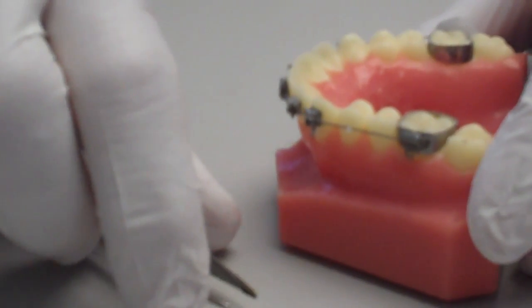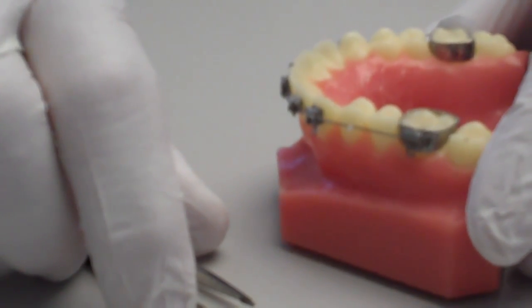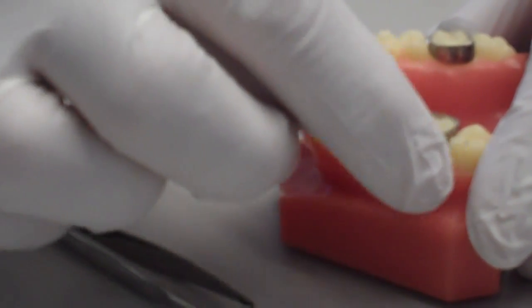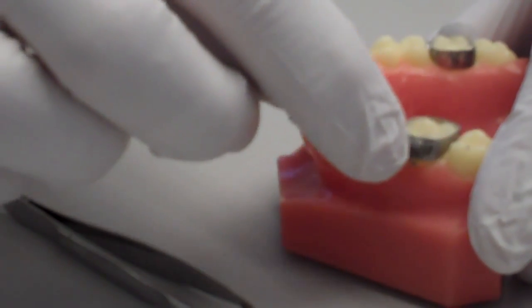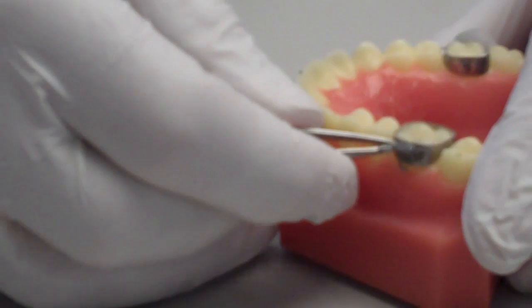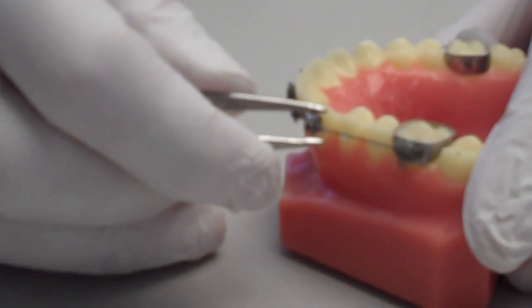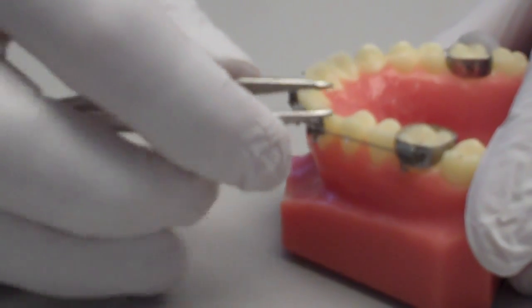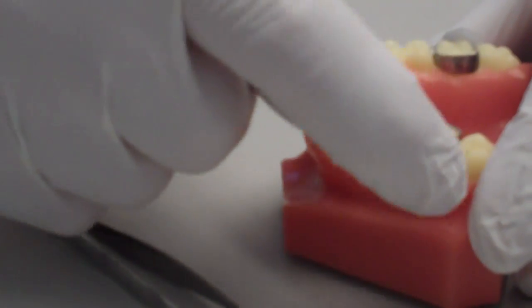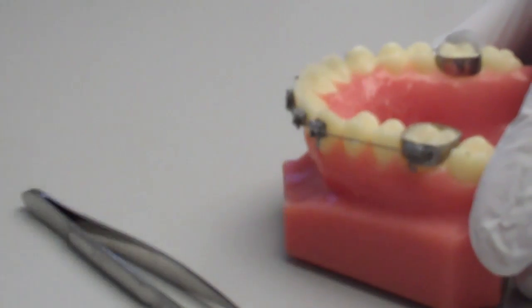Now, if that doesn't solve the problem, again, the solution would be placing a big ball of wax in that area to eliminate and avoid the irritation of the gums and the cheek. Oftentimes, though, the solution of bending the wire and placing it in the brace does not work for the thicker wires. The thicker wires will often tend to stay in place up against the teeth better, so they really only require a ball of wax to protect the area.